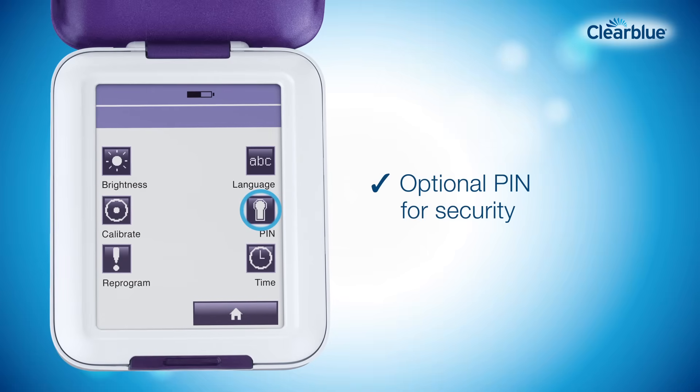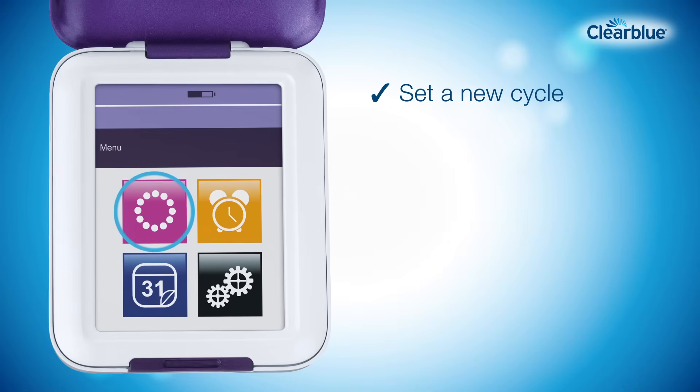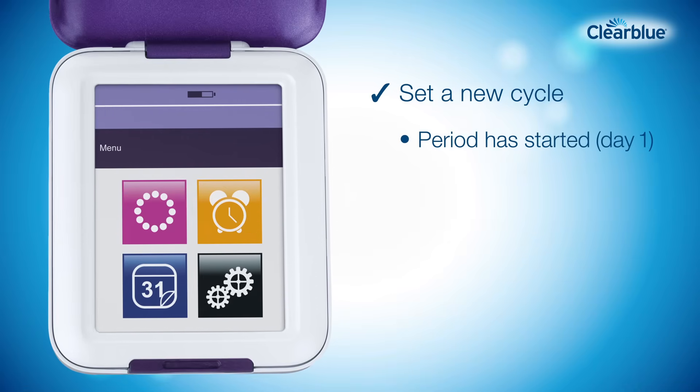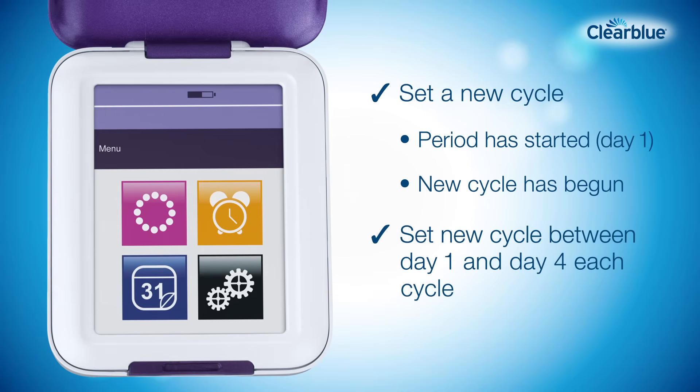You can also set up a PIN if you would like to. You'll need to set a new cycle to tell the monitor that your period has started and a new cycle has begun. You can do this between day one and day four.